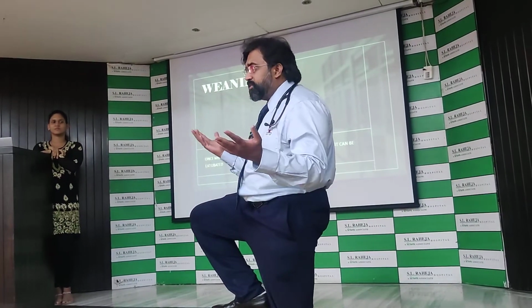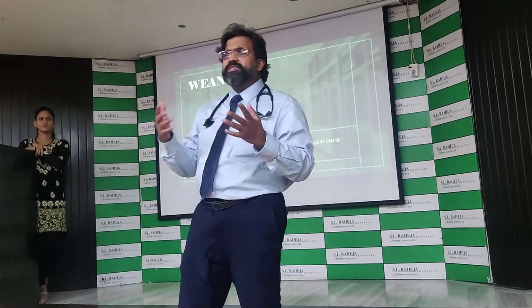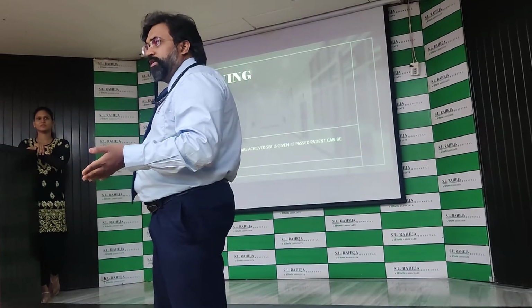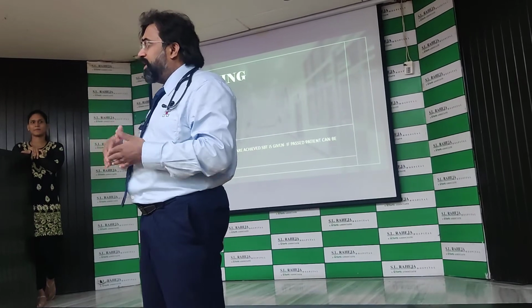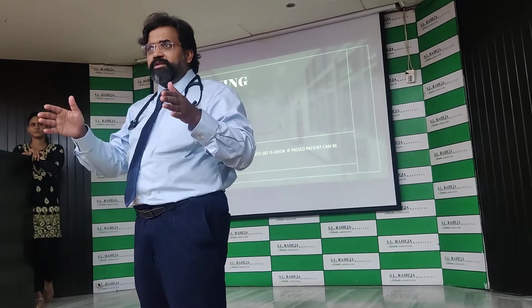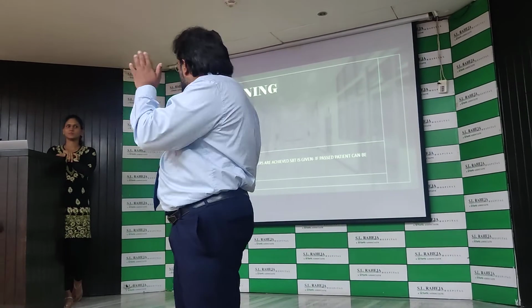His diaphragm is in a different league. His neural respiratory drive is in a different league. So a number of asynchronies would start coming in. What happens over here? Without you knowing, the ventilator picks up that this patient is taking a breath. And rather than giving the large tidal volume that he would otherwise receive, it still ventilates him in that box. So he gets a low tidal volume, he gets adequate pressure, and he's in that box.